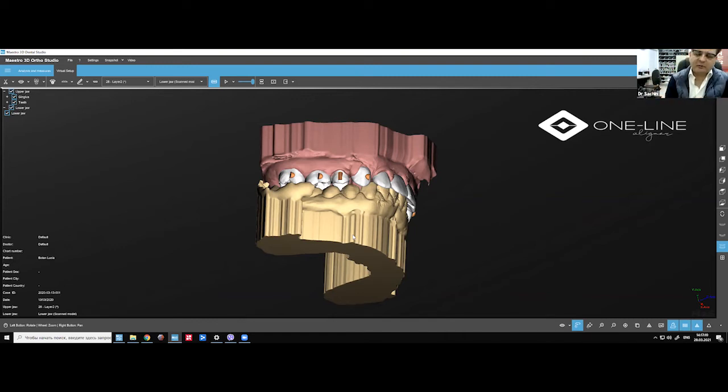So I would always agree with sheets which cover a part of the gums, not just the teeth. The more the surface area, the better for you. If you have a surface area which is less, then it's not really good for you.